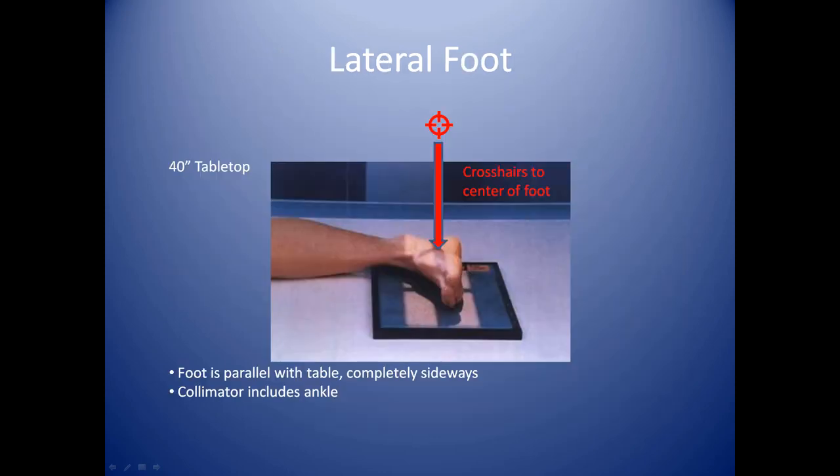For the lateral foot, you'll have your camera angled back to a straight 90-degree angle toward the table — perfectly perpendicular to the foot and to the table. We're at 40 inches, and the crosshairs are centered toward the center of the foot. Place the foot on the cassette and angle right at the middle of the foot so that you're including the heel, the toes, and the ankle in the entire examination. The reason we include the ankle is because the talus actually creeps up into the ankle joint.